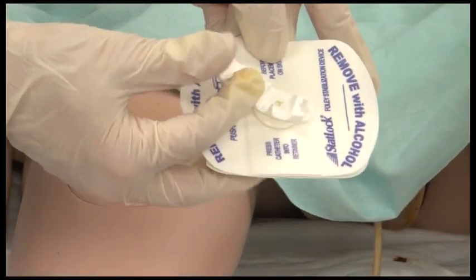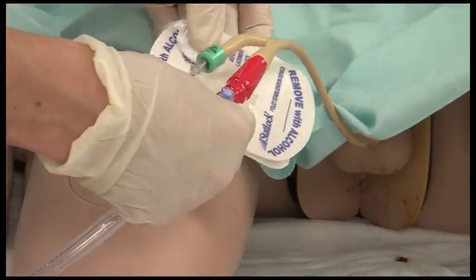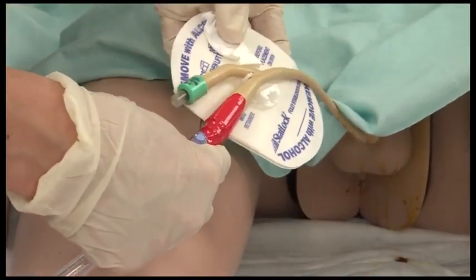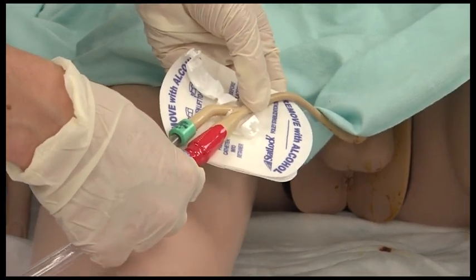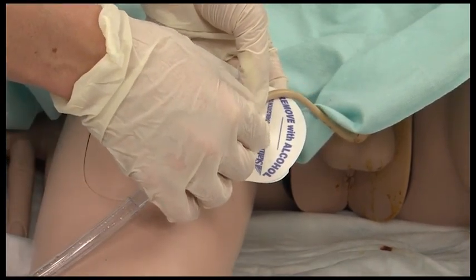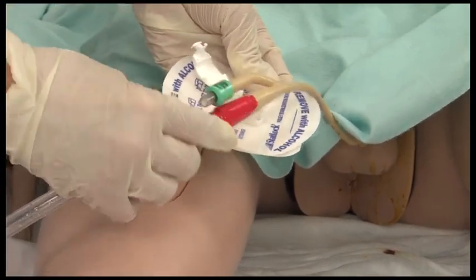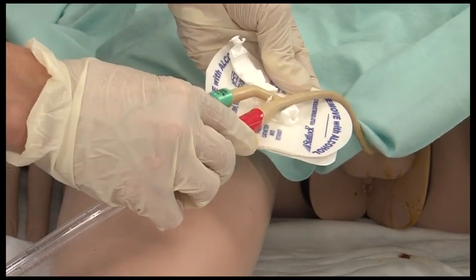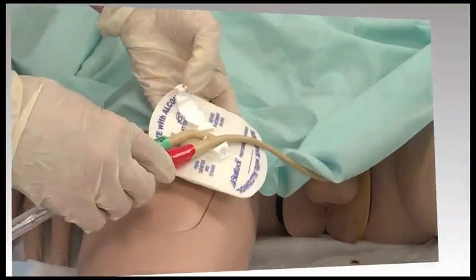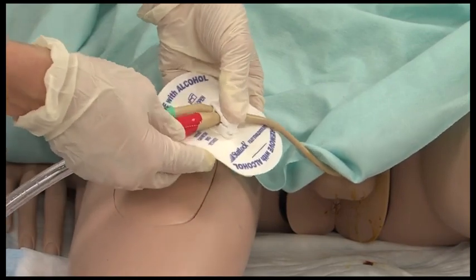Place the Foley catheter bifurcation into the StatLock device retainer. The directional arrow should point towards the catheter tip. The wide channel in the clamp should hold the drainage arm, and the narrow channel should hold the balloon arm. Be sure the bifurcation hits the post in the clamp to seat the device properly. Close the lid by placing your fingers under the pad and pressing the grip markers at the end of the clamp with your thumb, being careful to avoid pinching the catheter.